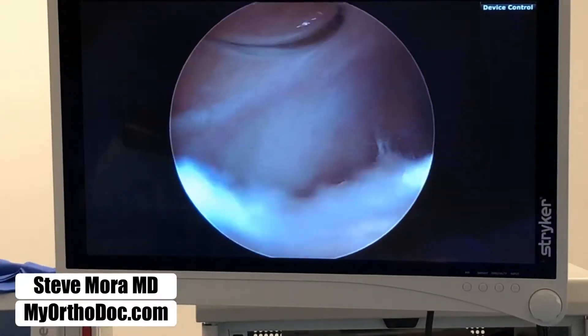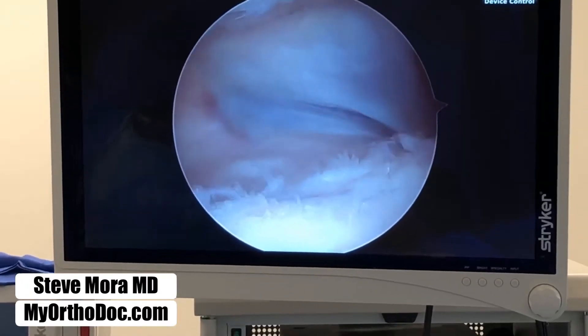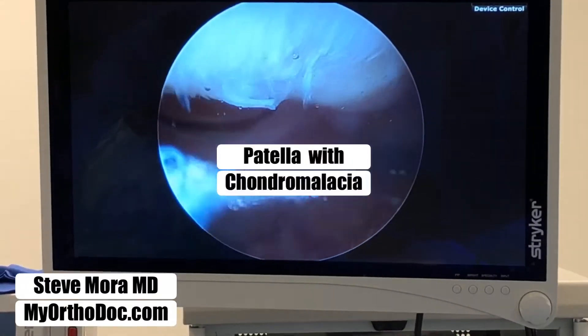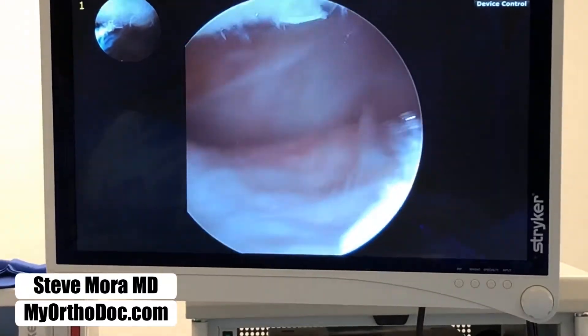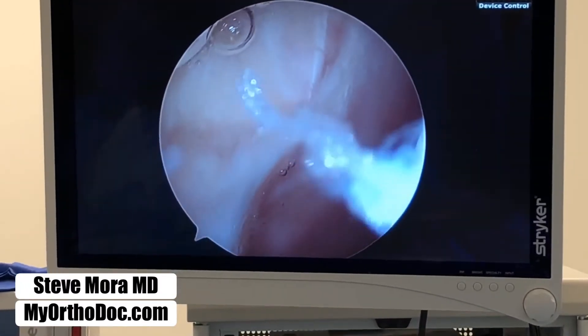So I use my camera to look. This is the quadriceps tendon. We back it up and look up — patella chondromalacia. Chondromalacia basically means that the cartilage is irregular and rough. Look over medial — this is where the patient has pain. So I'm in the medial side of the joint.